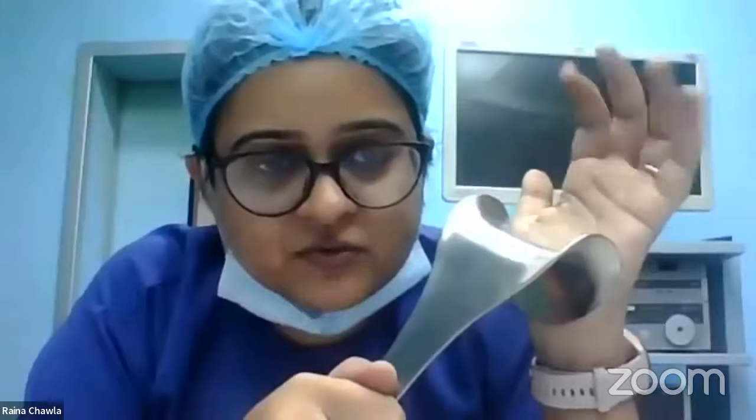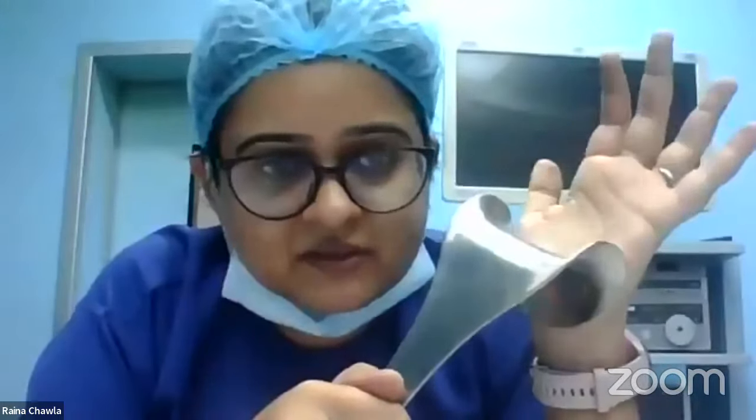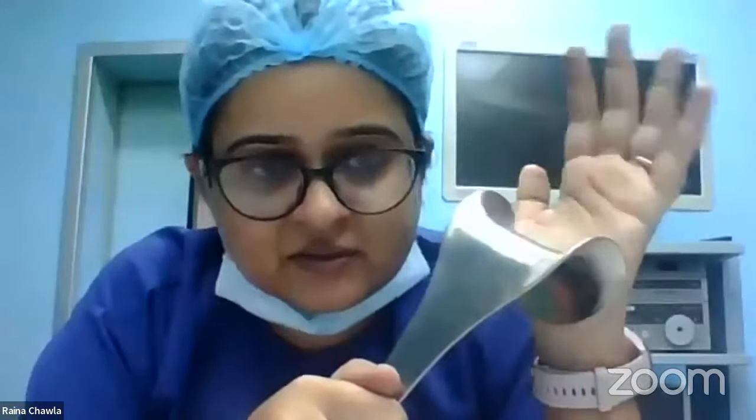Okay. And then with the same BP handle, I give a nick on the uterine incision, extend the nick. And now I am in the uterine cavity. So I can deliver the baby. Once the baby is out, I clamp the cord. We usually clamp the cord with artery forceps. Okay. Or any forceps you can use to clamp the umbilical cord, and then cut the cord, give the baby to the pediatrician. The placenta will come out next.